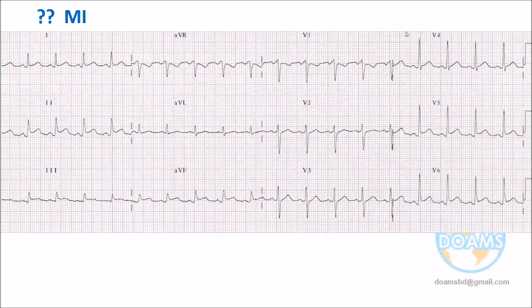So is it MI? Is it MI? Yes, doctor. Which MI? Which area? Which segment? That means which territory? Inferior, lateral. Inferior first, lateral. Identify inferior and then come to the lateral if there.